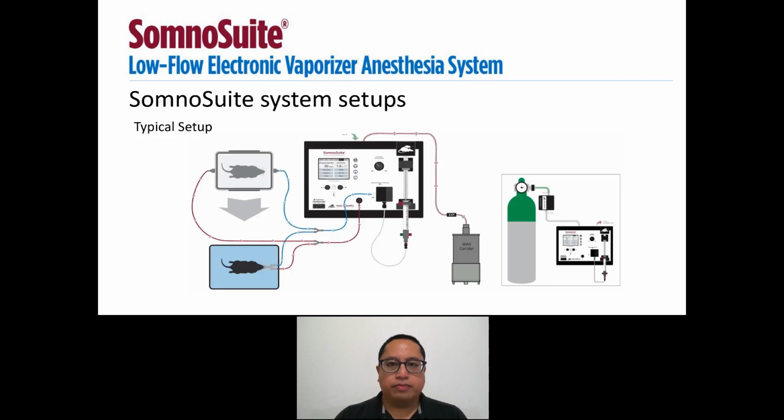Here we go. The diagram insert displays a typical setup with an induction chamber and a face mask using the 2 accessory adapter. The anesthesia outlet, marked in blue, is the inspiratory line. This line comes from the vaporizer block and splits into 2 branches, each into either the induction chamber or the mask. Leading out from both the induction chamber and the mask is the expiratory line, marked in red. This line passively carries waste gases to the WAG canister.